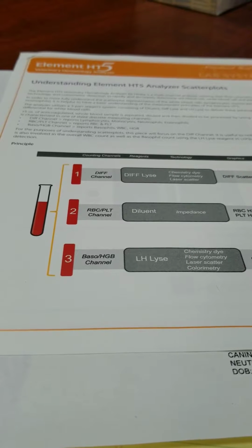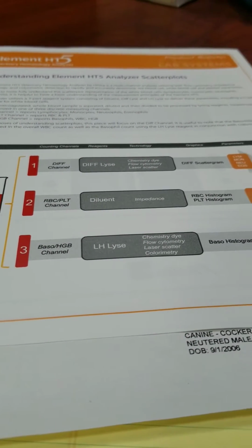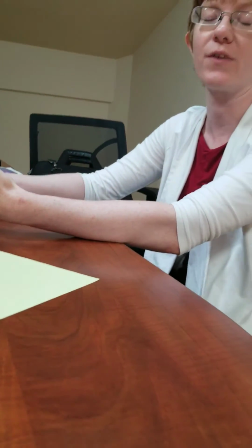With the dry chem, hemolyzed samples do affect your values. But there is a handout that I will forward to you guys that actually lists out every single one of the values and how they're affected.